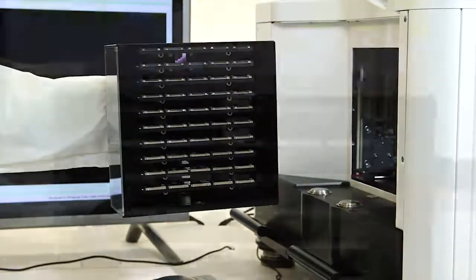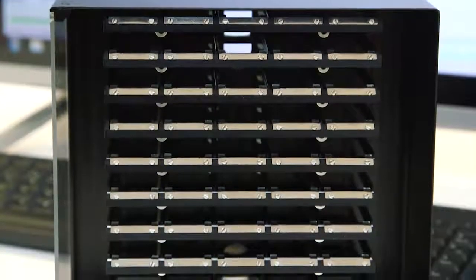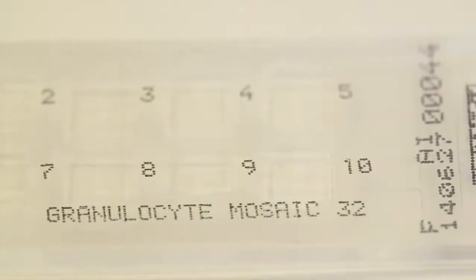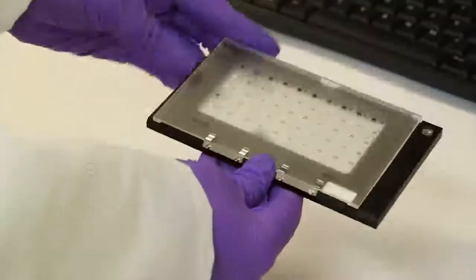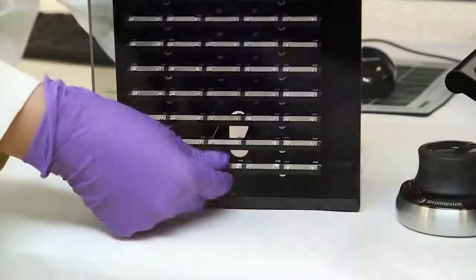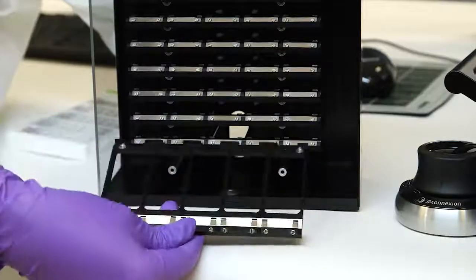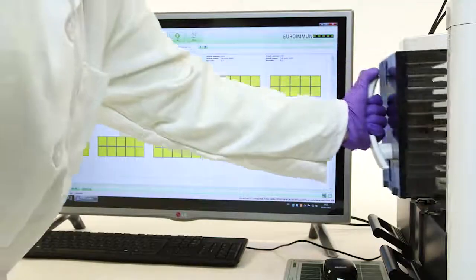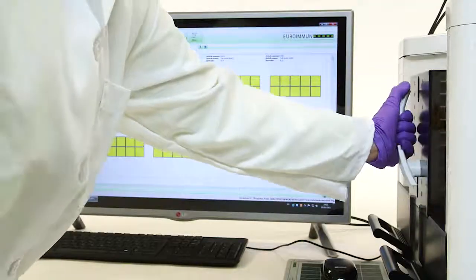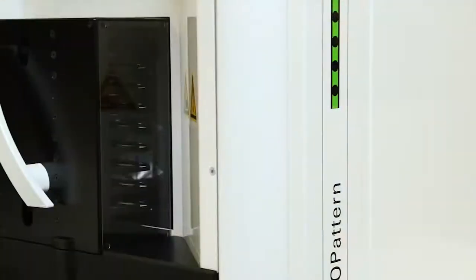Each carrier cartridge in the magazine can be equipped with five five-well slides, five ten-well slides, or one 50-well slide. The total magazine capacity is 500 wells. Once loaded, place the magazine into the Europattern. You are now ready to begin processing the run.